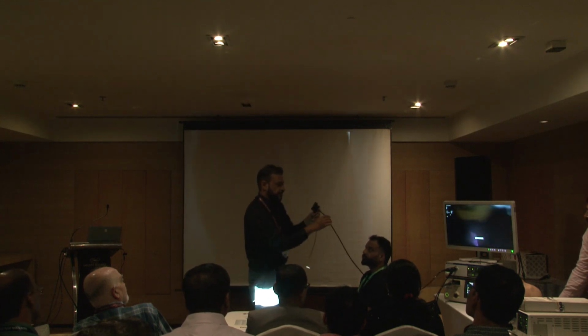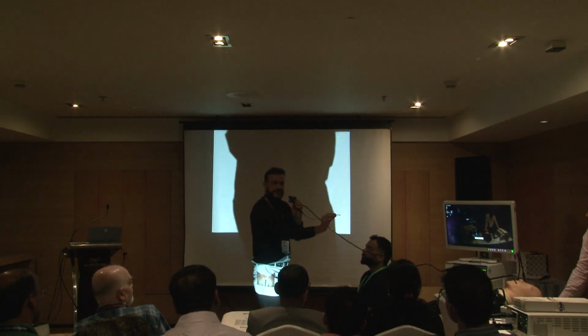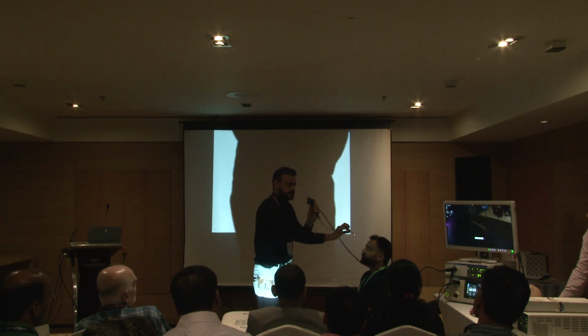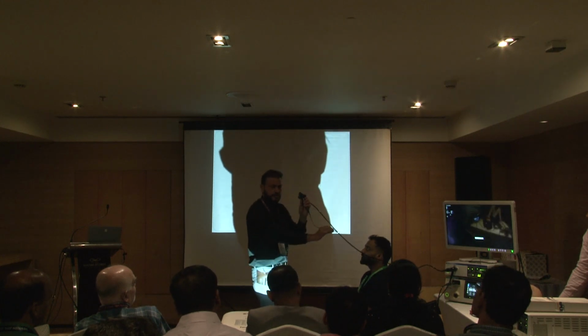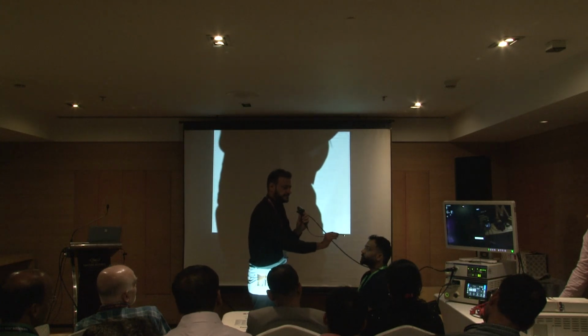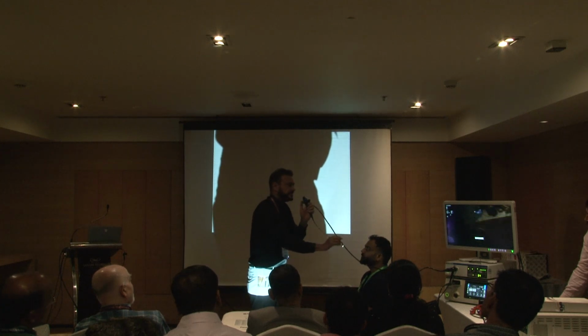Now, a lot of times when we are putting the scope inside, we are holding it like this and it goes inside. All of you are able to understand what I am saying. We all do the same thing. We hold it from here, go straight inside, and my left thumb is controlling the movement of the scope. So this goes inside.